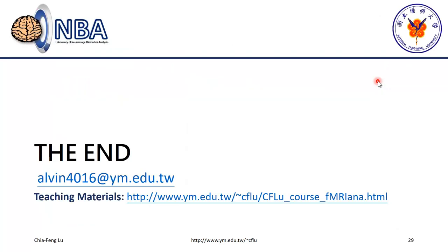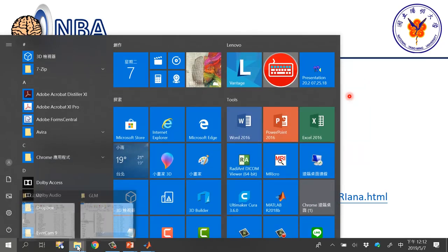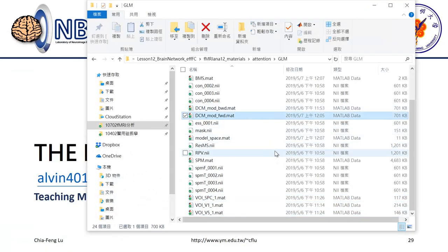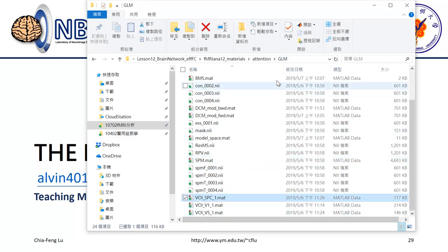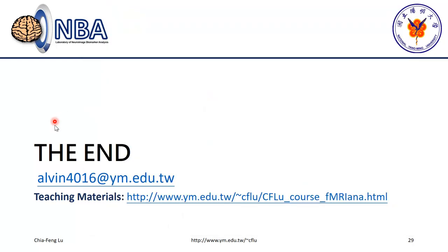That's all for the DCM tutorial. I went through all the processes quickly due to time constraints, but all files are available under the GLM subfolders — including the SPM.mat file and the three VOI files for V1, V5, and SPC. Today we walked through the basic ideas behind GLM and how to use attention modulation during visual stimuli as an example to perform a three-region DCM analysis. If you have any questions, please come to me.